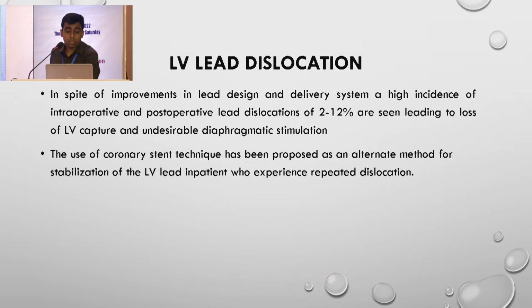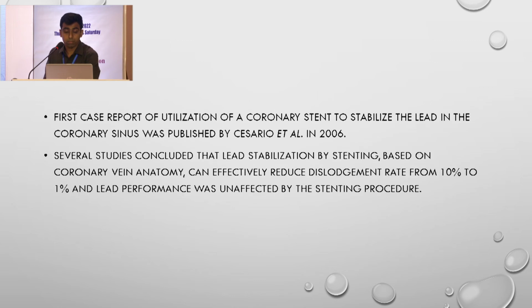In spite of improvement in lead design and delivery systems, a high incidence of lead dislocation is observed. It is between 2 to 12%. The use of the coronary stent technique has been proposed as an alternative method for stabilization of the LV lead in patients who experience repeated dislocation.